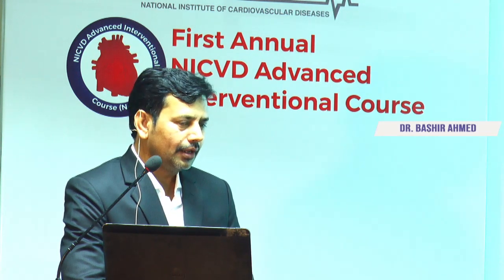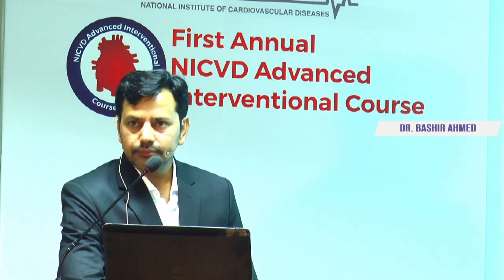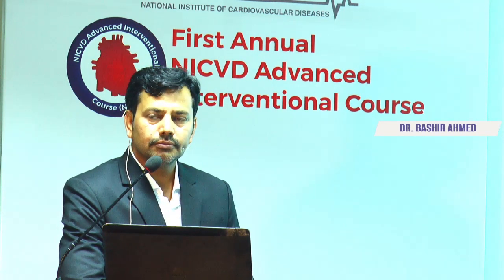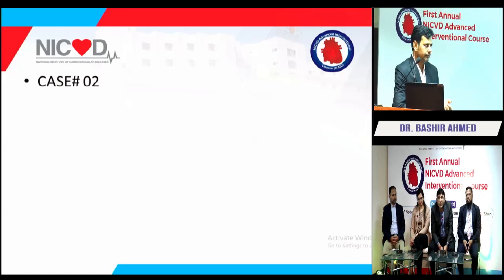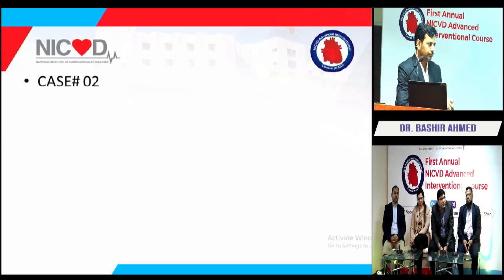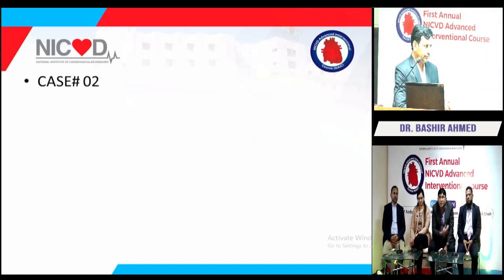Apart from the complications related to other PCI, like no reflow or arrhythmia, typically with rotablation the patient may develop dissection or perforation. The important ones are rota burr entrapment or rota wire shaft fracture. These types of complications can be encountered, and one should know how to come out of them.